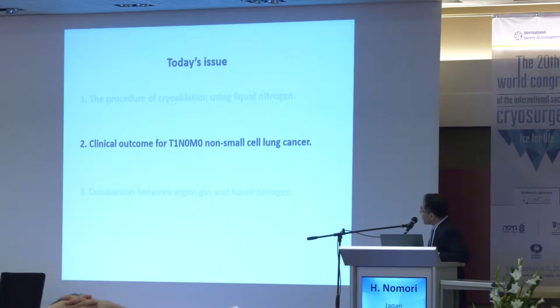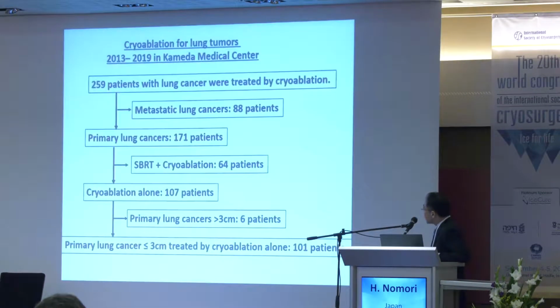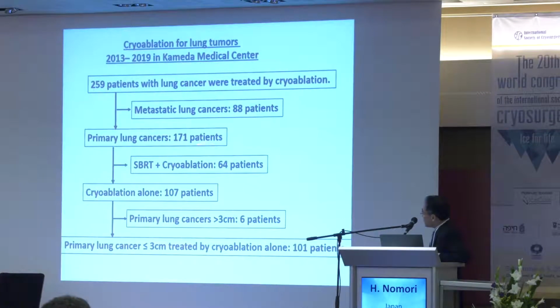Now, let's go to the second issue, the clinical outcome for T1N0M0 non-small cell lung cancer. Between 2013 and 2019 in Kameda Medical Center, which is my previous working hospital, 259 patients with lung cancer were treated by cryoablation. Of these, 88 patients were metastatic lung cancer, and 171 patients had primary lung cancers.